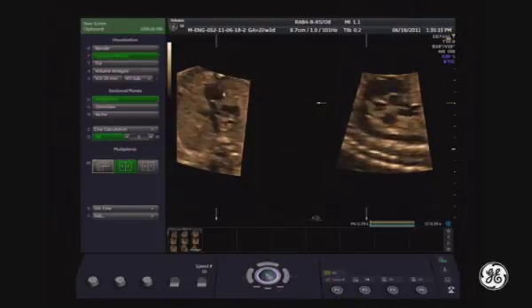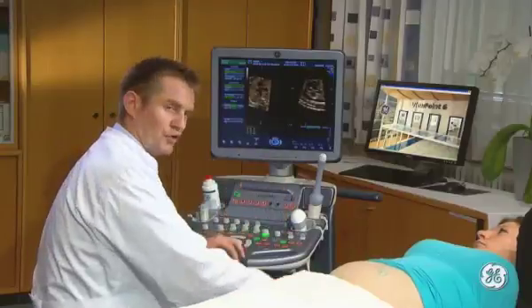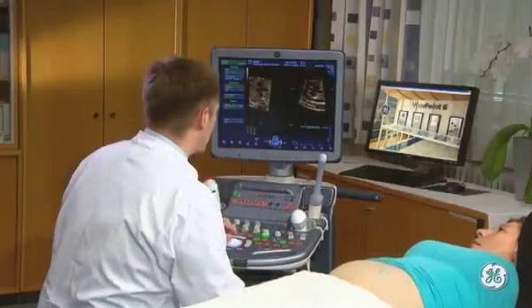So you can see the right outflow, the pulmonary valve, the main pulmonary artery with its branching, the ascending aorta, and the superior vena cava. When I move my pivot point slightly higher, I should connect the ascending aorta with the descending aorta, so that they will form the aortic arch. So let's try to do it.